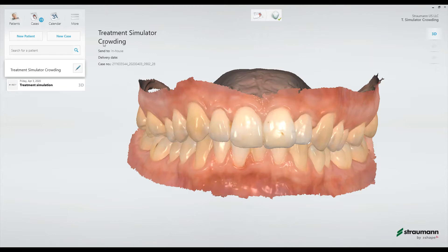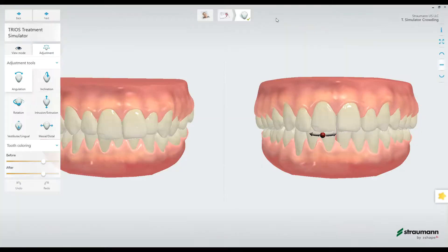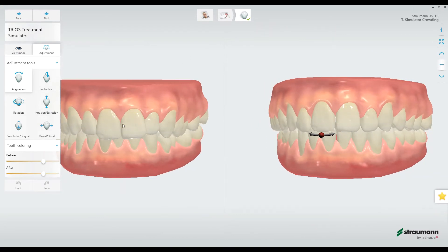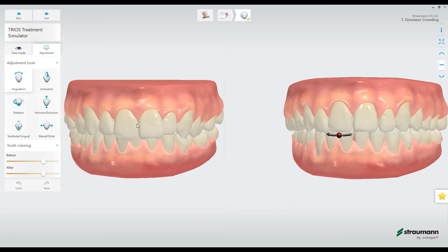Today we'll be looking at the Treatment Simulator crowning example. To go into the Treatment Simulator app, I simply click on that icon in the workflow, and we'll see that the system automatically generates this animation based on the scan that we took from the patient.